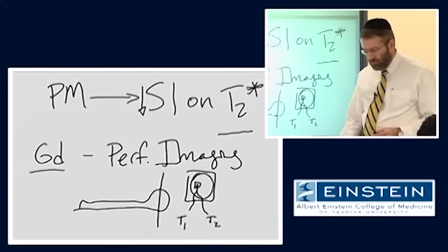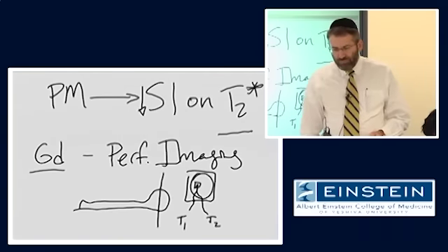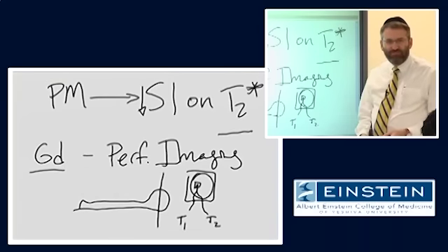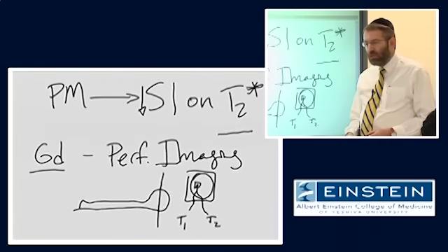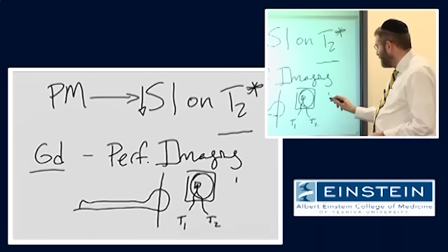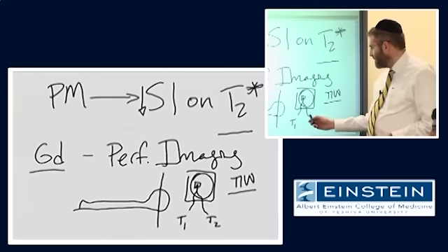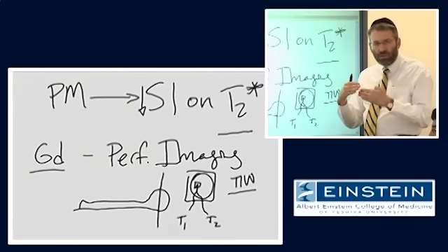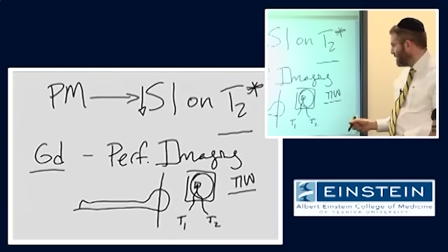In general, well, the answer is it depends, right? It depends on the type of image. So first of all, if this would be a T1 sensitive image, we would expect that there's gadolinium in the tissue at the time we acquire the second image, causing that proton-electron dipole interaction, acceleration of T1 relaxation, and increase in the signal amplitude.